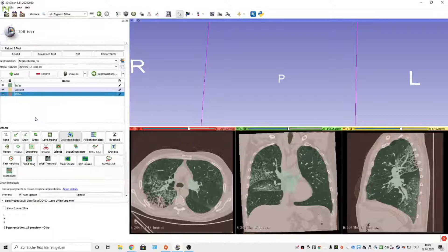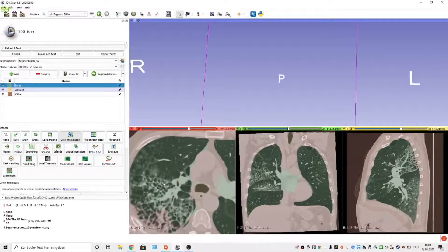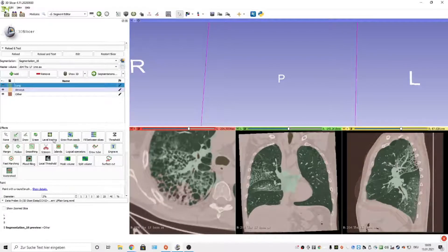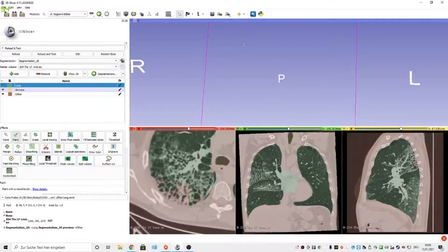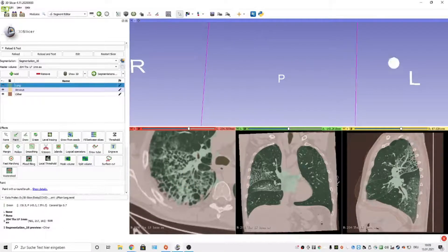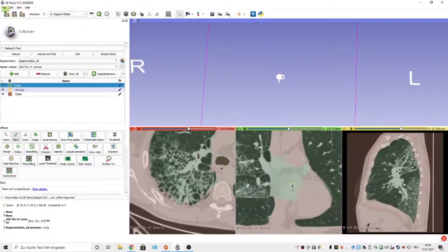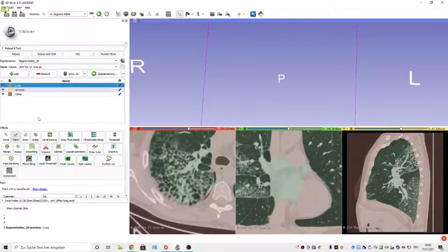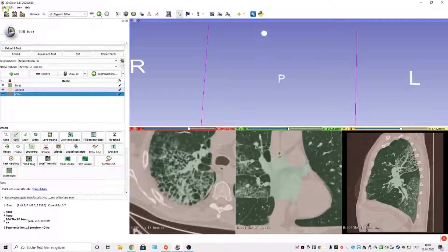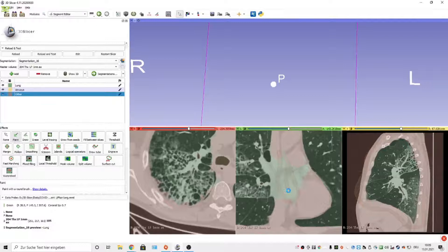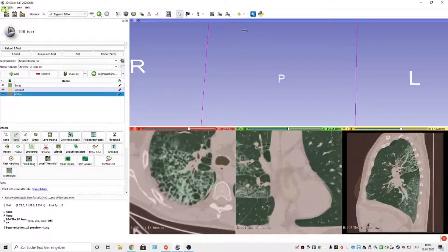So I'll show you how to correct this. We go to Lung, zoom in a little bit, and use Paint to paint over the area that has been missed. This seems quite okay now. Now we go to the leak area here — we need to select Other and paint in the area of the heart. The Grow from Seeds will update with each paint stroke. This looks okay now too.